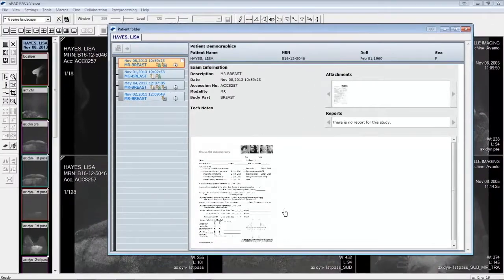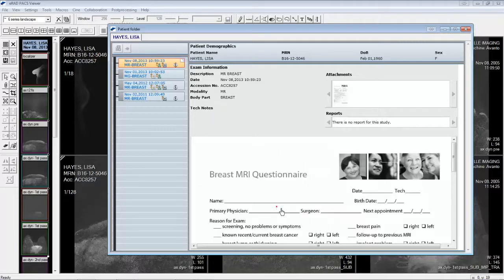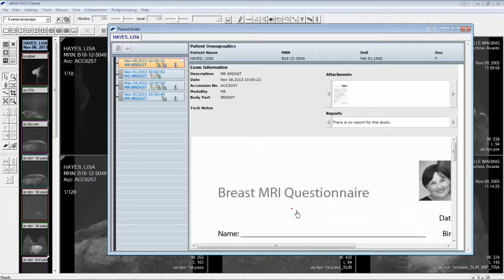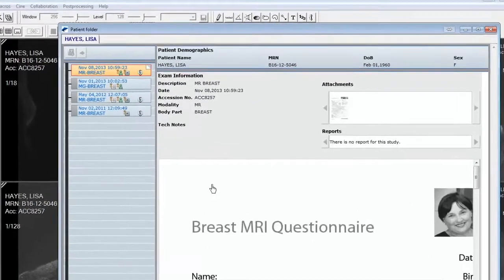Once in the image area, you can use your left mouse button to change display modes from fit to window, to fit to width, and full resolution. Final reports are flagged with a gray bar on the left edge of a timeline item.